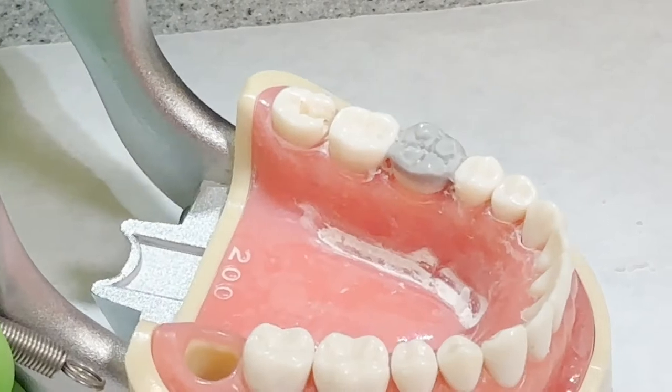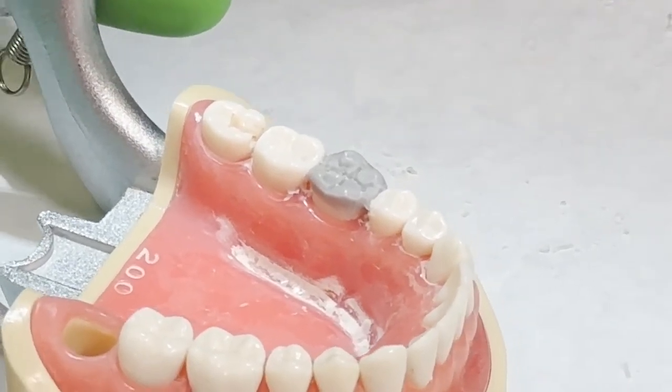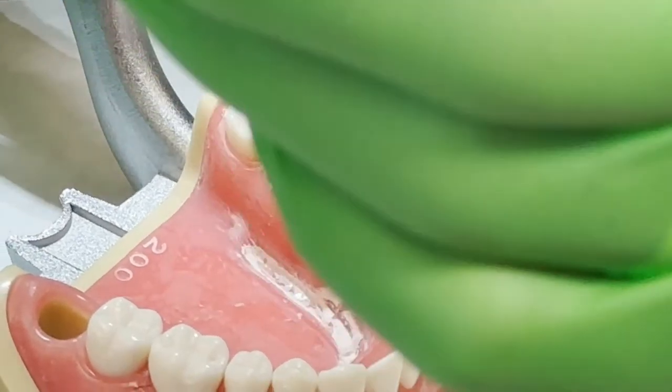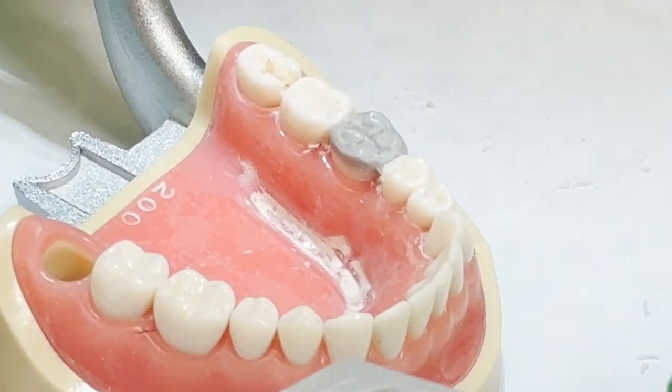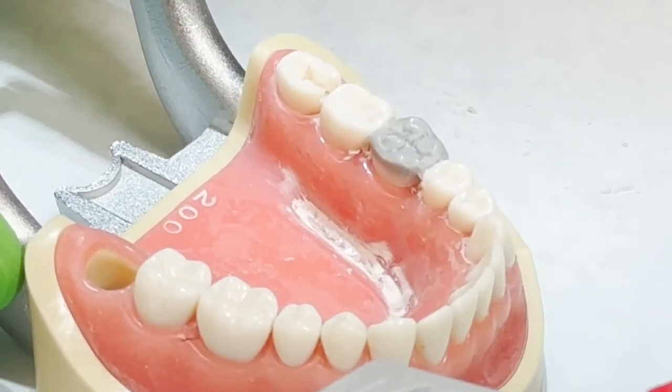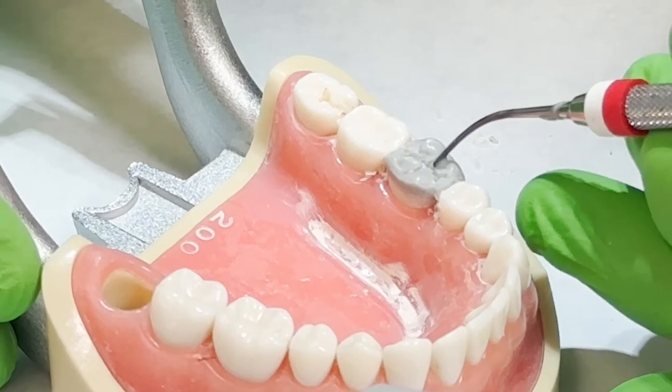Everybody see that? Can you see the general outline? Now I'm going to go back to the waxing. Some of these cusps are a little flat, so I want to try to make some triangular ridges. See if I can get away with some of that. So I see this, I want to build this cusp up.